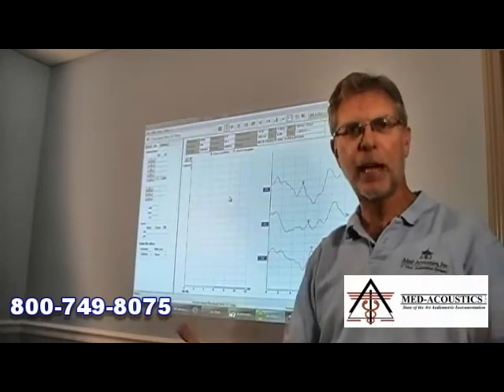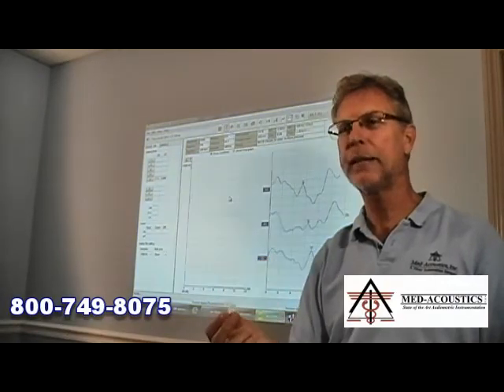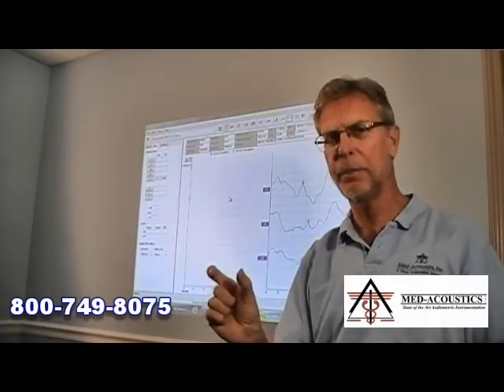So I hope that's helpful. And we also, if you go to Med-Acoustics.com, you will find an introductory lecture that we did a couple of weeks ago on electrocochleography, and it includes some samples, which you'll see, and also the area under the curve measurement.